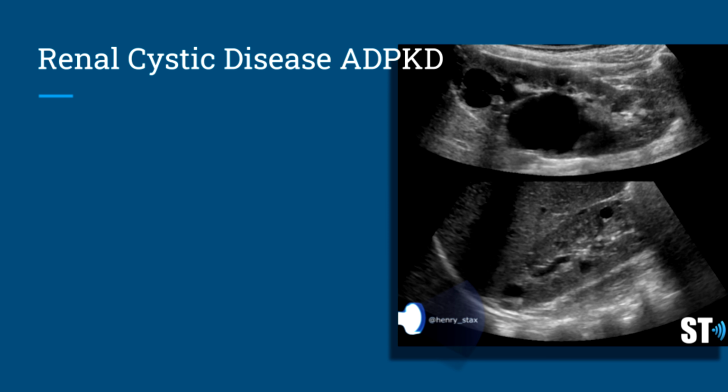Here we have a young male. Both kidneys, one of them has small cysts throughout, and the other one has a couple larger cysts with smaller cysts throughout the parenchyma. These patients, we follow them up every 6 months to every year, and we scan them and we see the progress of their disease. Some of them stay pretty stable, others progress faster.